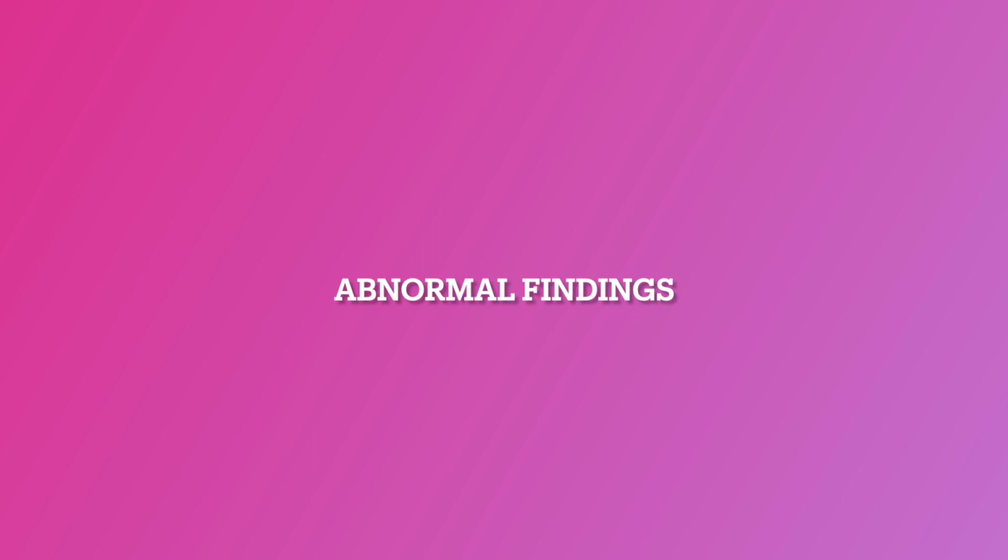So I have captured a few abnormal findings while performing the FATE in our institute, and I am sharing them in this video.